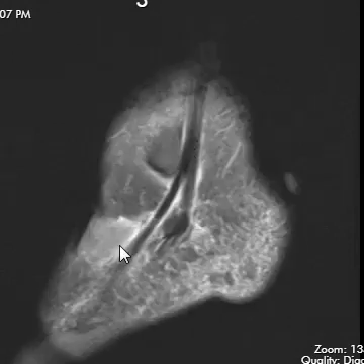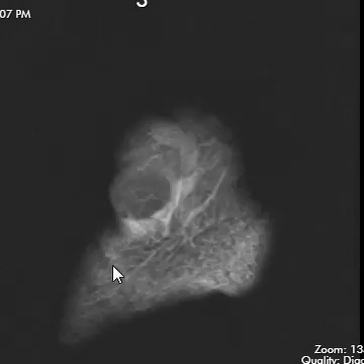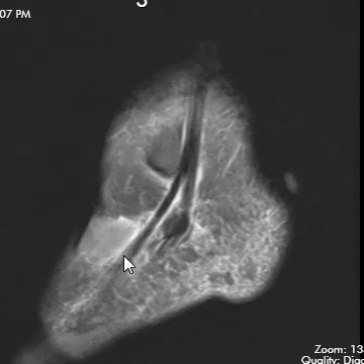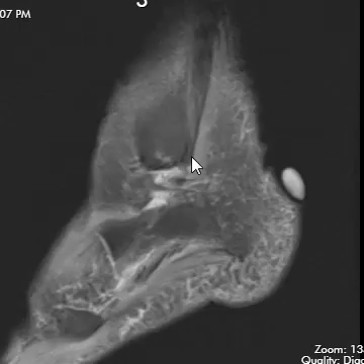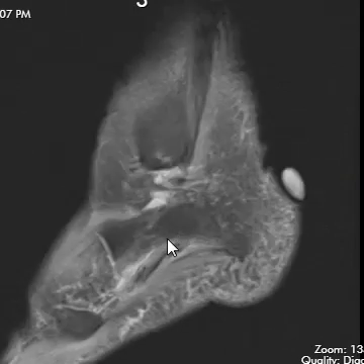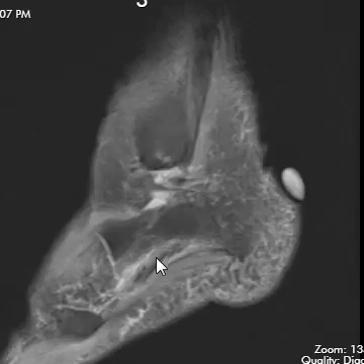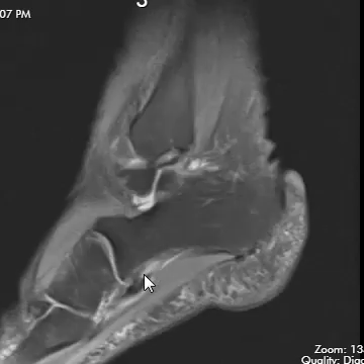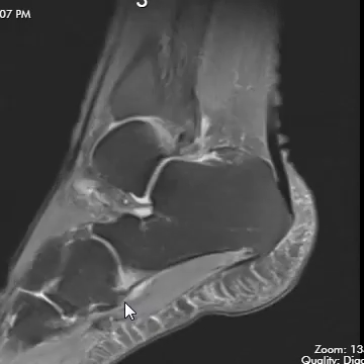Now the angle is no longer 55 degrees with the foot and toes pointed downward — the angle is straightened. This is the peroneus brevis tendon coming down; we do lose it a little bit further down, but that may be related to volume averaging artifact. And if we look at the peroneus longus tendon, it comes down and as it loops between here and here we do see some signal within it — it's not completely absent like before.